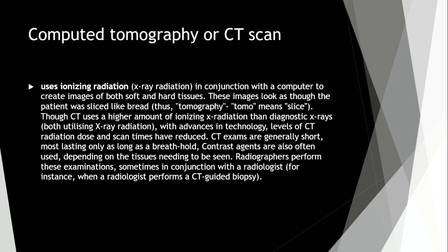CT exams are generally short, most lasting only as long as a breath hold. Contrast agents are also often used, depending on the tissues needing to be seen. Radiographers perform this examination sometimes in conjunction with a radiologist, for instance, when a radiologist performs a CT guided biopsy.